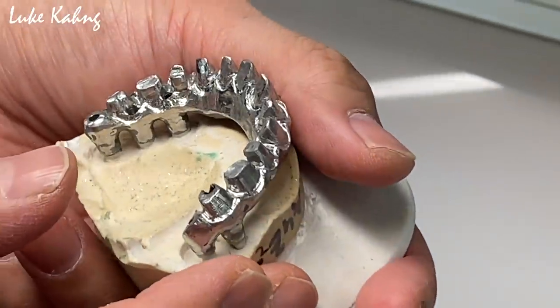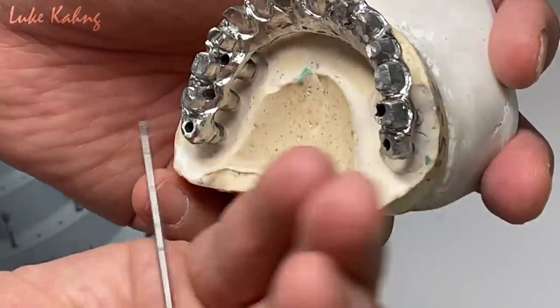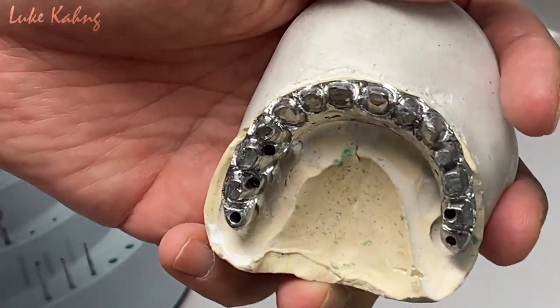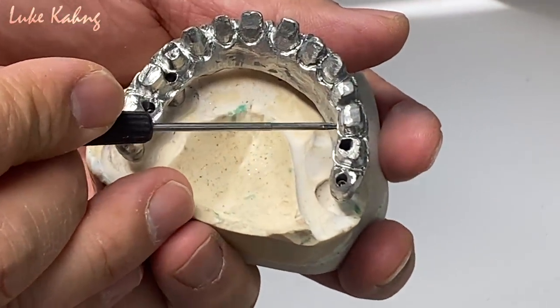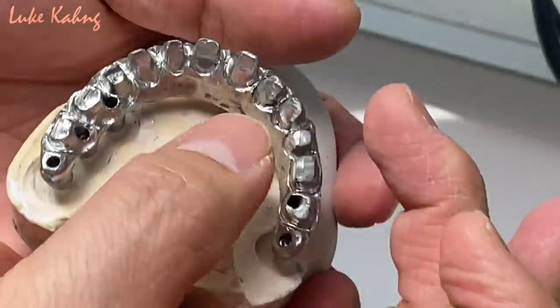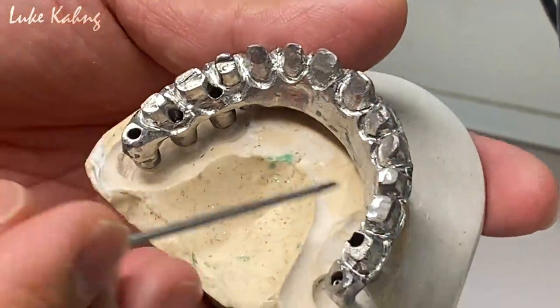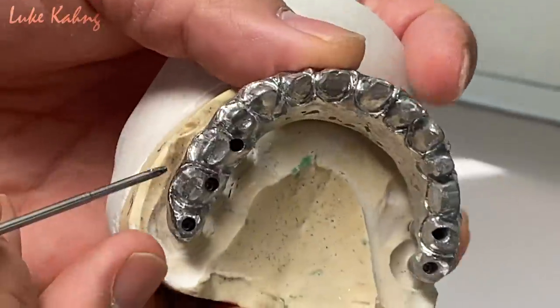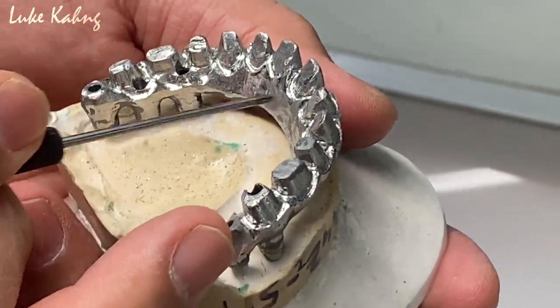Okay? All right. So we're going to cut the whole. Here we can grind more down. Grind more down, and I don't mind. You can make it a little bit deeper. Make the same line, so we can get a retention of the crown. So we're trying to make the single crown for this. That's why I need a little bit more retention. Just a little bit longer. More down. Longer. The cervical.